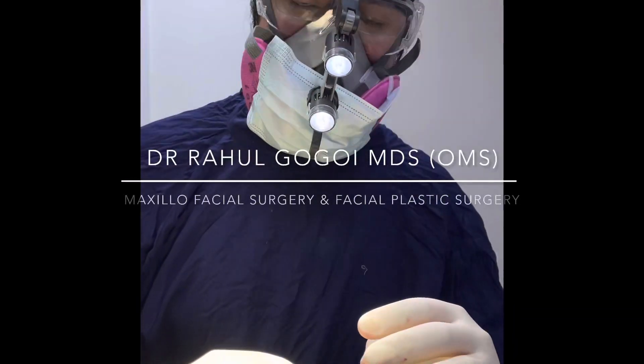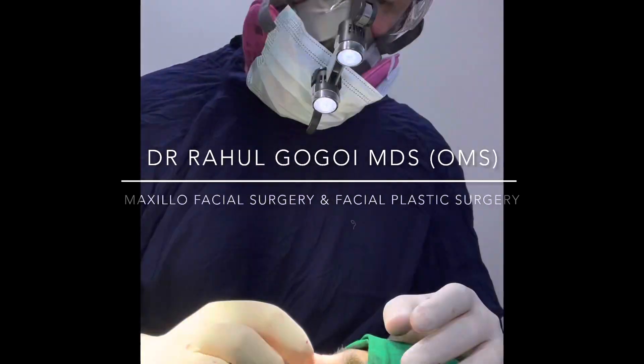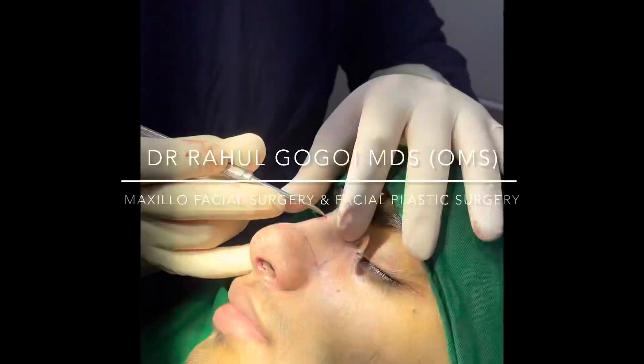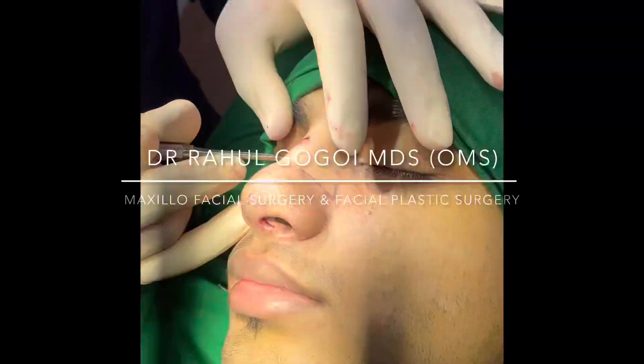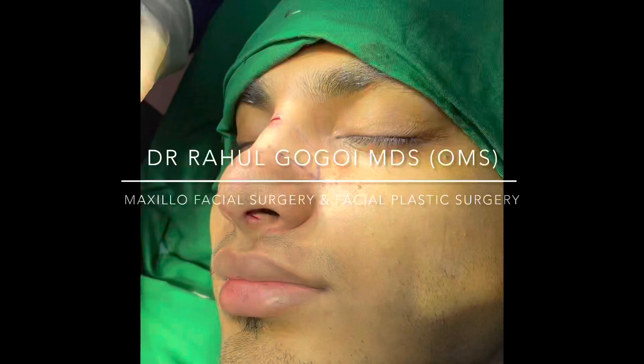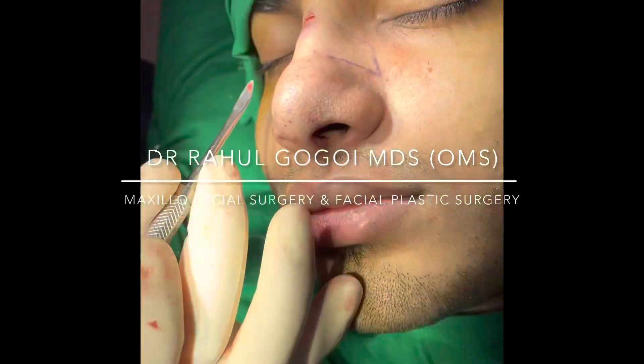We are doing a preservation rhinoplasty. What we've done is the osteotomy from here — small — and we've gone down all the way in here. From here we've gone down here, and from inside we've stuck the bone here and here.